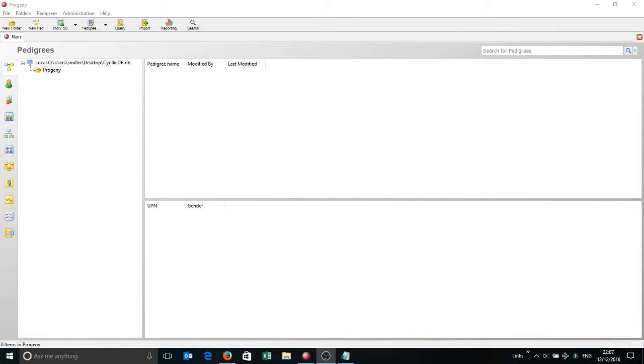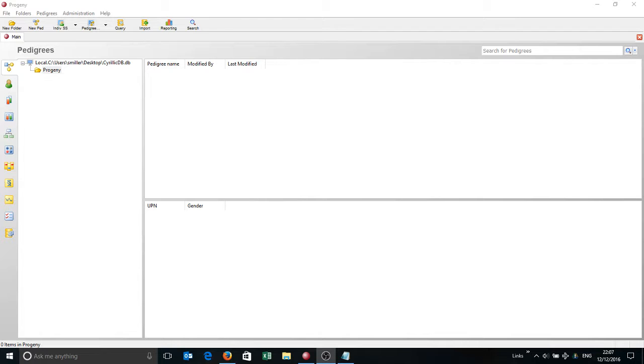Hi, it's Doc Progeny here and today I'm going to be importing some Cyrillic Pedigrees into Progeny Clinical and then going to do some work to display the data that's imported along with those Cyrillic Pedigrees. I'm using the PC Client version, Progeny 10.0.1.0.